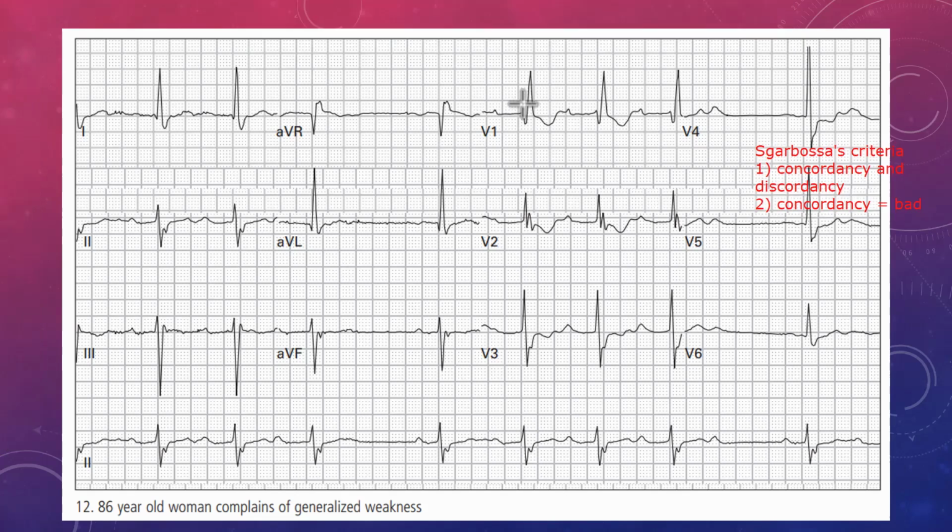So in other words, if you have a QRS complex like this, and let's say our ST segment, let's get another color, sorry about that. So let's say we have our QRS complex just there, and then, sorry about that. Just trying to take it out from the line. I'm not sure why it's not letting me.